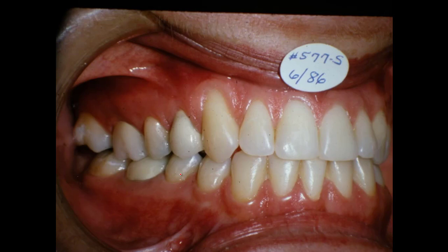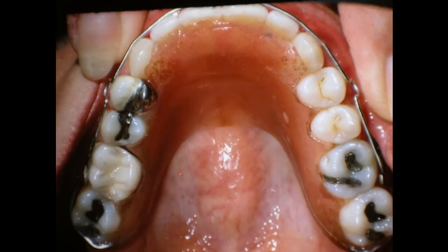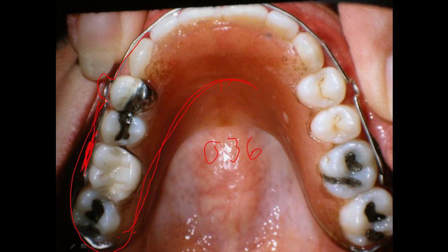Alright, this is the other side of the mouth. Same thing. And up above, now we built a retainer that goes in here, and this wire will go around. That's an 036 round stainless steel wire. It comes from way over here, goes out to this part right. Well, actually we bring it up here, didn't we? Take this loop and bring it back and solder these together about where the 6-year molar is. And you can see where we do that.